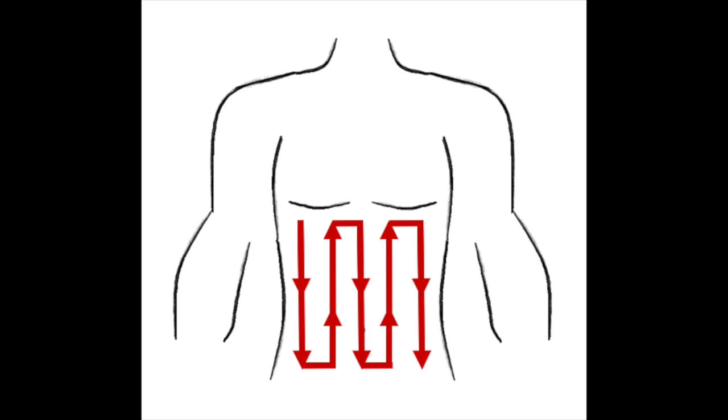Getting right into it, we're going to use a diagnostic approach called the lawnmower technique, which is to use the curvilinear abdominal probe over the abdomen, essentially going up and down or side to side across the abdomen in a lawnmower-type fashion. This will ensure that you capture all the quadrants of the abdomen without missing any, which will increase your diagnostic yield.